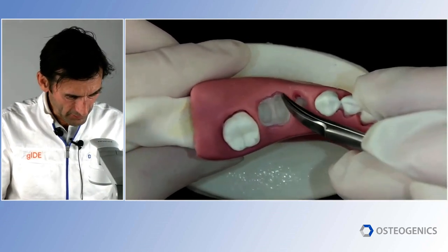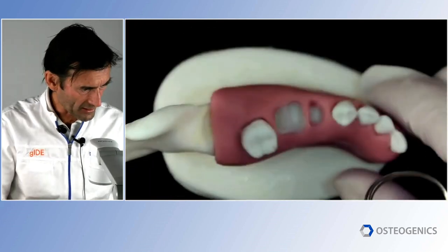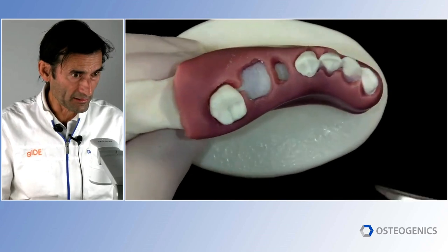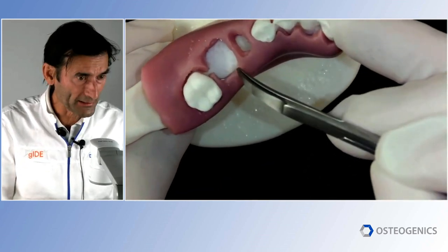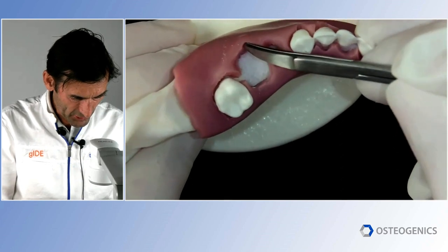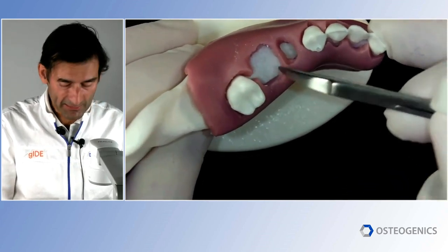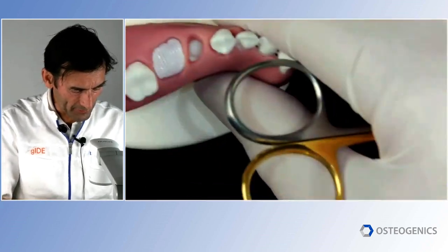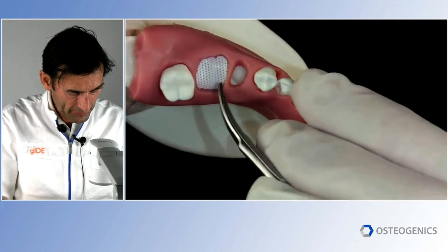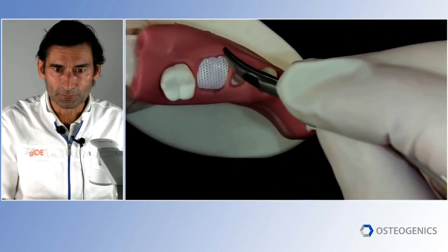And now I need to do the socket graft, right? So I did my socket graft already. Actually my associate here did it already. Placed the bone graft into place here. See, a nice job here. And it's at the crest. And now I'm using a cytoplast membrane, right? Our traditional technique to keep everything in place. But now, of course, you want to do a suture.